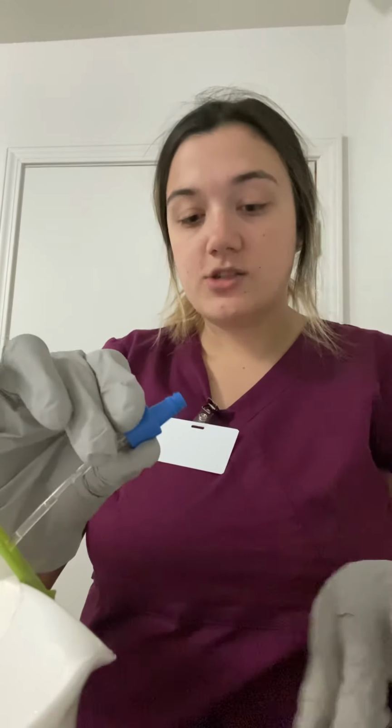And now I'm going to push the medication by removing the needle, putting that in a sharps container, and I'm going to put this up here. I need to unclamp the medication, and I need to push 4 mils over 2 minutes, is what it says in the drug book. So I'm going to do it a little faster here, but that's what I would do over 2 minutes according to the drug book. So now I want to undo that, put this in the sharps. I want to clamp this back. And now that that's clamped, without touching the end right there, because you want that to remain sterile.